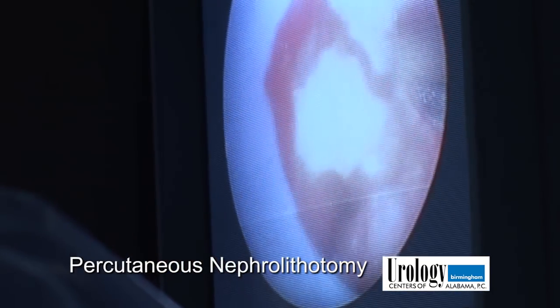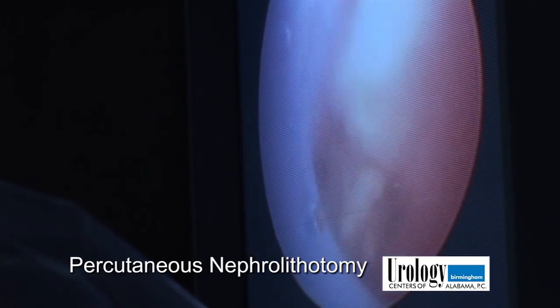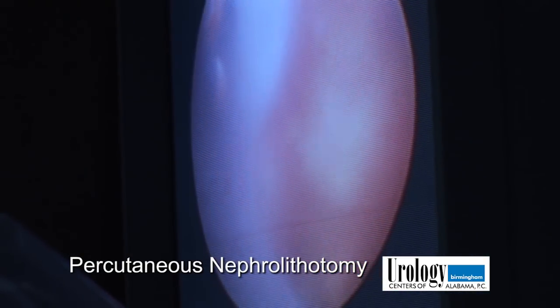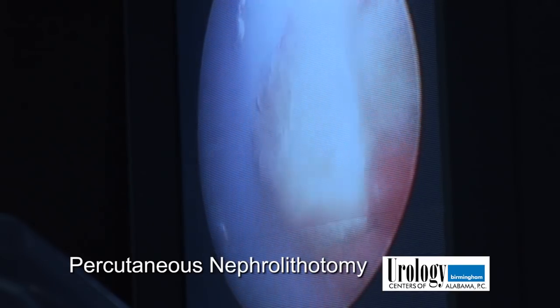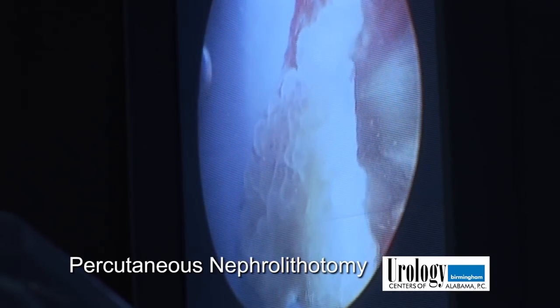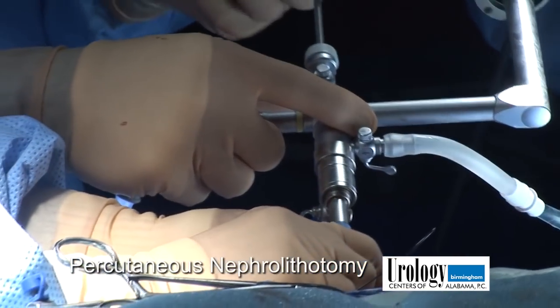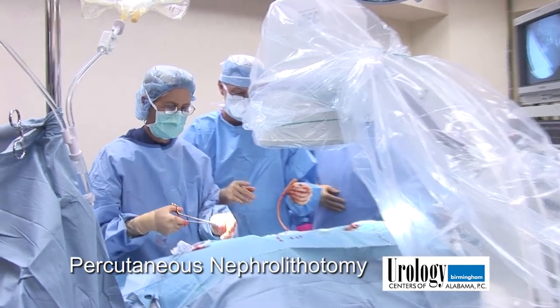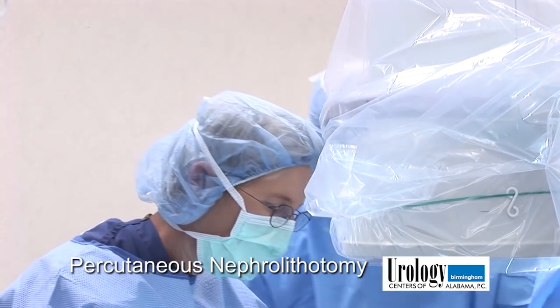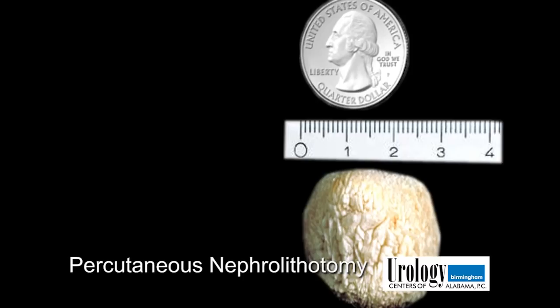I think this is the last of the stone here. That was about a three centimeter stone in the upper pole of the right kidney, and we were able to get it and remove it with one access — one needle access — which is good for the patient. We just went directly on top of the stone to remove it.